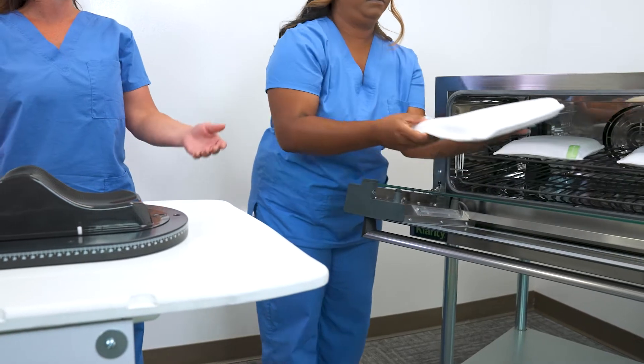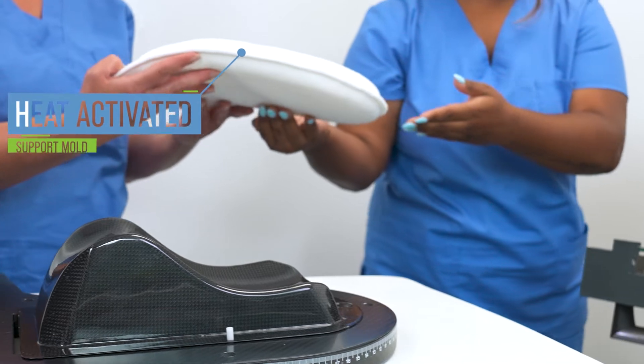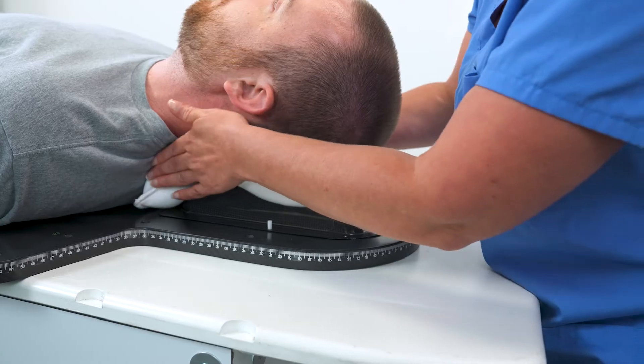The Clarity Cushion is an odorless, heat-activated support mold for customized patient positioning. The Clarity Cushion is unique in that it's heat-activated rather than water-activated. This means there's less mess, no chemicals, and no odor.